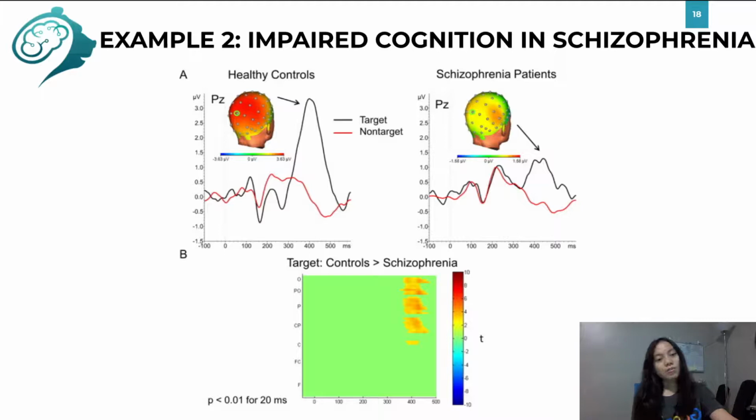So this is important because the different ERP components are ordinarily mixed together, making it difficult to determine exactly which component and which psychological or neural process differs across conditions or groups. So difference waves can pull out a subset of the components, making it possible to draw more specific conclusions. So in this study, the difference waves allowed the researchers to better isolate the P3 wave and to focus on brain activity that reflects the classification of the stimulus.